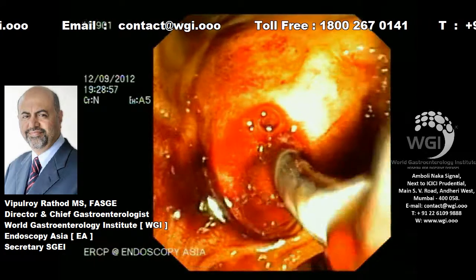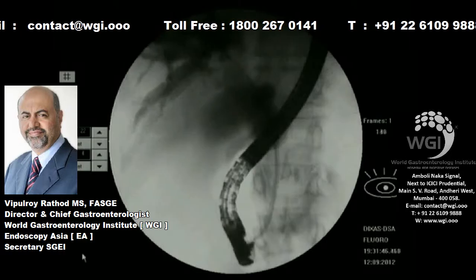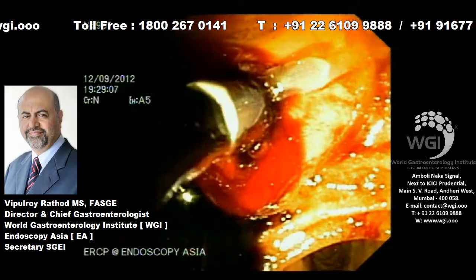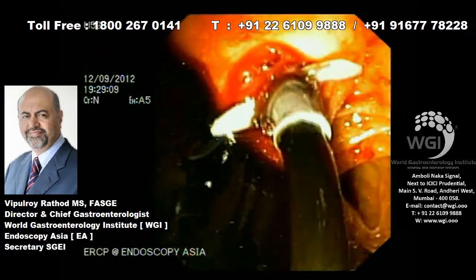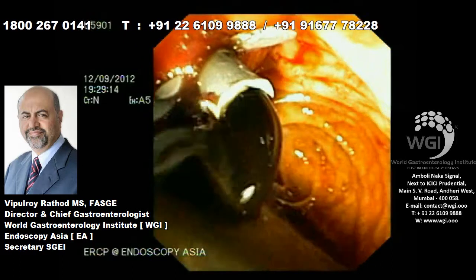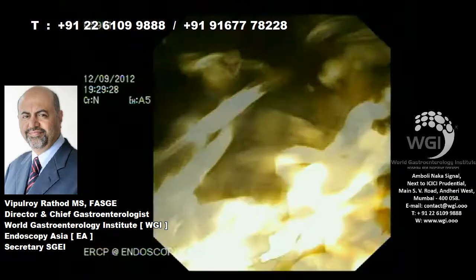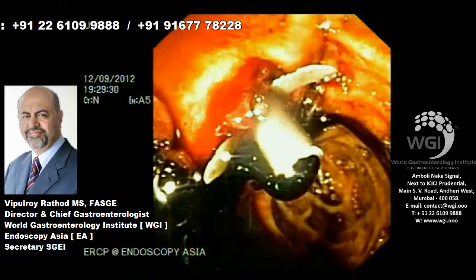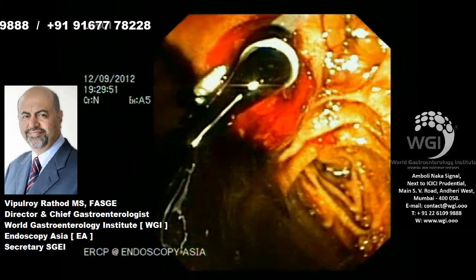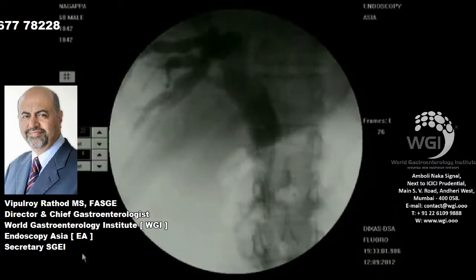So here we are putting a plastic 10 French Teflon stent, and you see gush of dark infected bile, free flow. As you can see here, a tremendous intraductal pressure leads to free flow of dark infected bile, and this completes the EUS-ERCP interface procedure for this patient. Free flow of bile seen and optimal stent deployment seen on fluoroscopy.